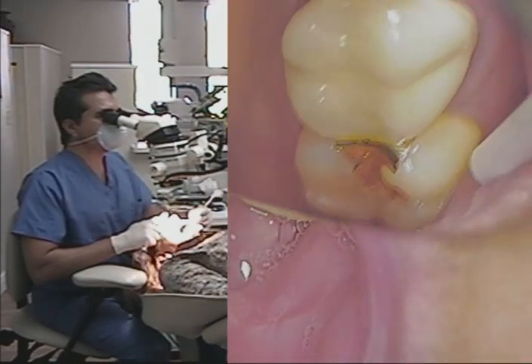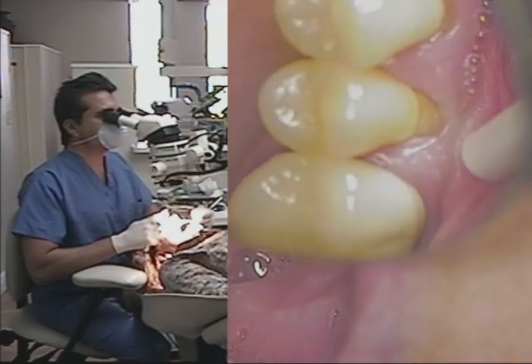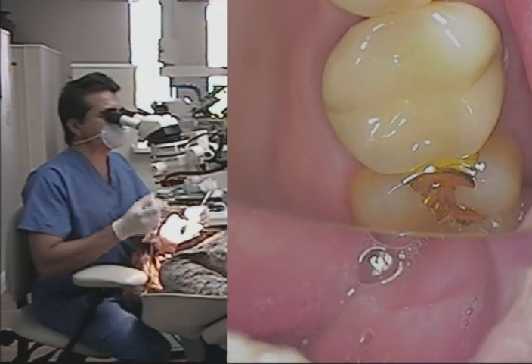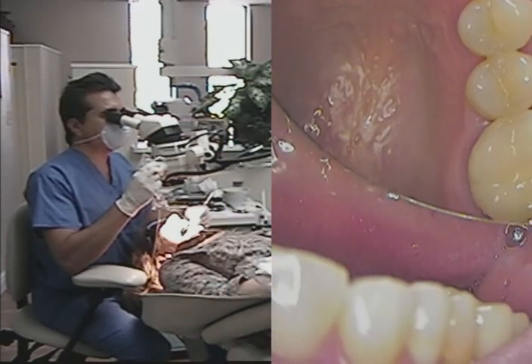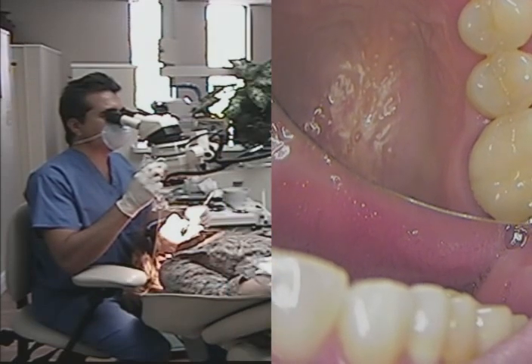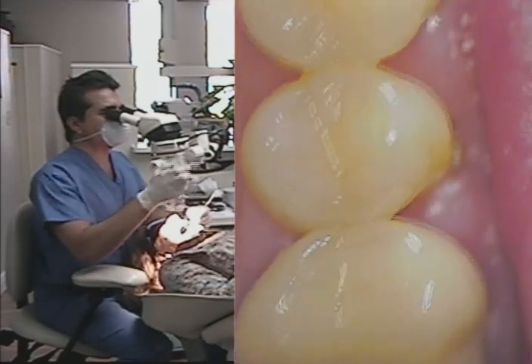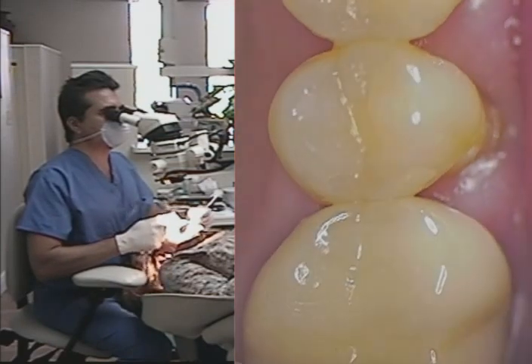I would say we need to do a couple of Class 1 fillings here. I think she agrees too. Back to 3.15, up to 5, and now we're up to 8 power. Look at the definition sitting right now at 8 power — this is well beyond loupes.